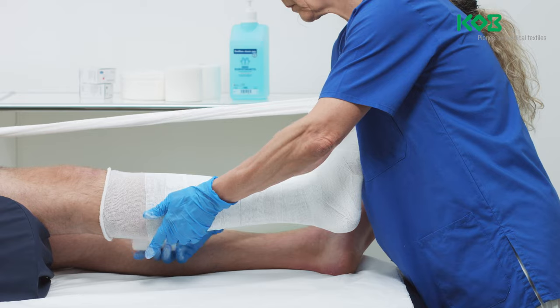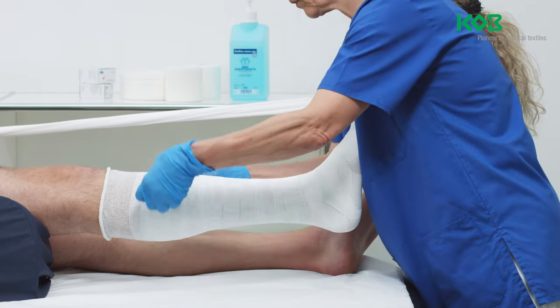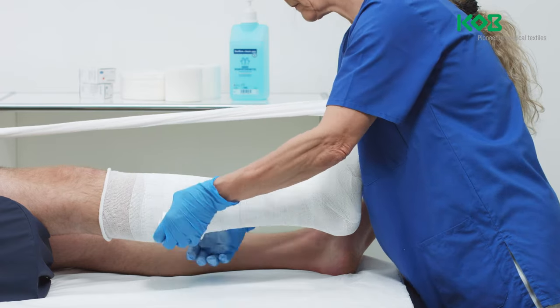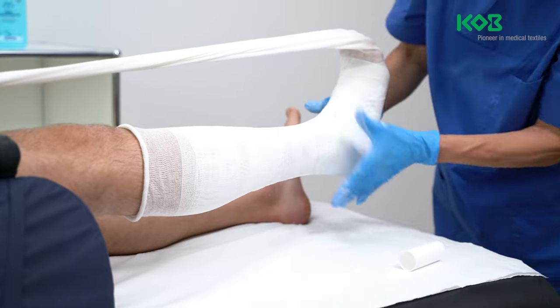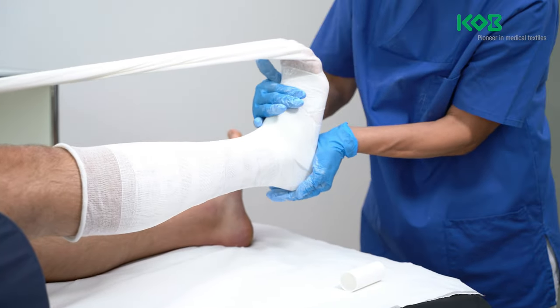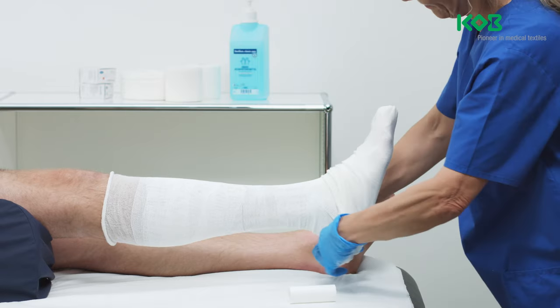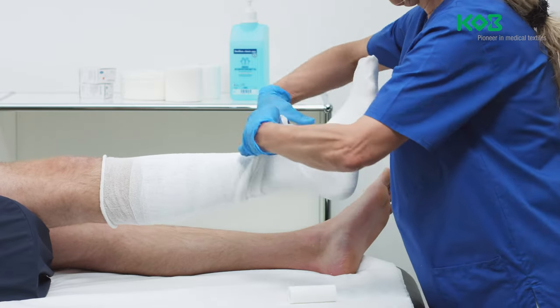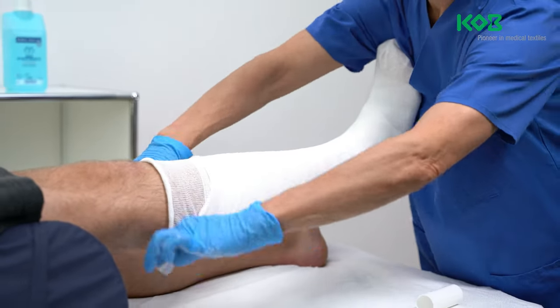Create an elliptical anchor proximally and apply the bandage moving distally. Complete the process by wrapping the bandage with increasingly narrower and centered overlaps and gently mold the zinc paste bandage onto the leg. Once applied, cover it by gently turning and pulling the tubular bandage back into place in the distal to proximal direction.